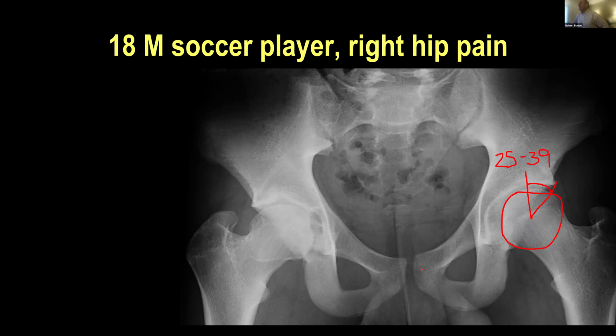Yeah. And the reason that it's important that it be an AP pelvis rather than an AP hip is that the radiographic central beam is here, and it's diverging out to here, and so that's all baked in. Whereas if you have a central ray for a hip AP that's here, the beam's not diverging, and all the measurements are based on having that AP pelvis rather than AP hip.